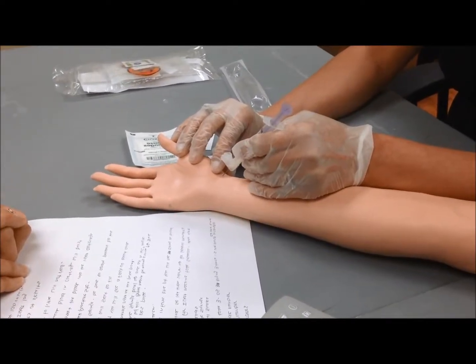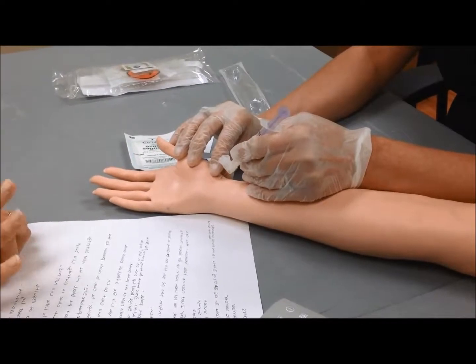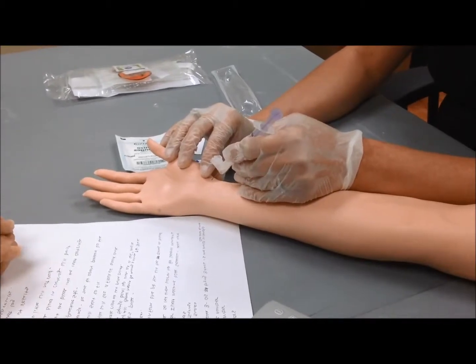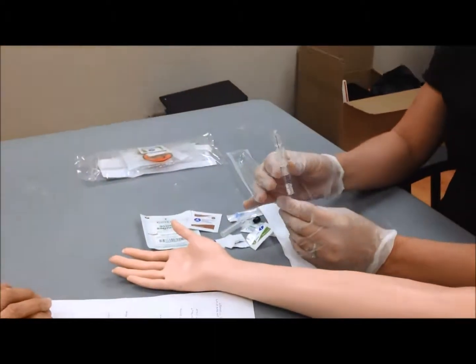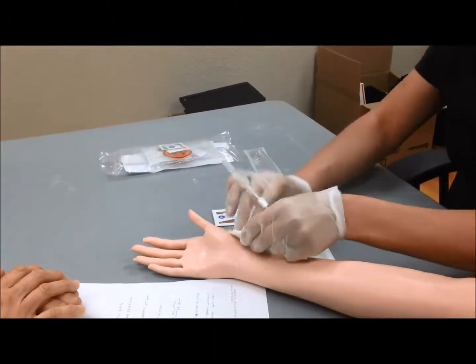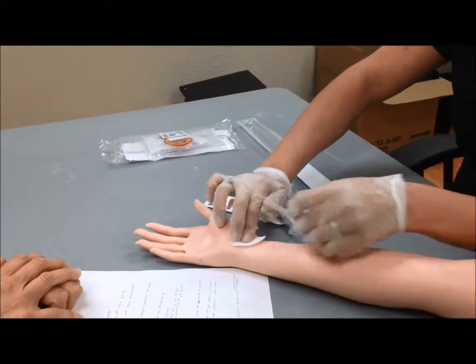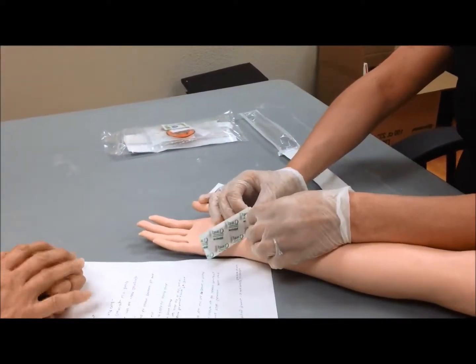Once you've gotten enough blood, which probably takes maybe a half a cc to a cc, but get as much as you can, because you might need a couple of tries with the cartridge. Remove the needle. Apply pressure to the puncture site. And carefully insert the blood after you've put the Band-Aid on the patient.